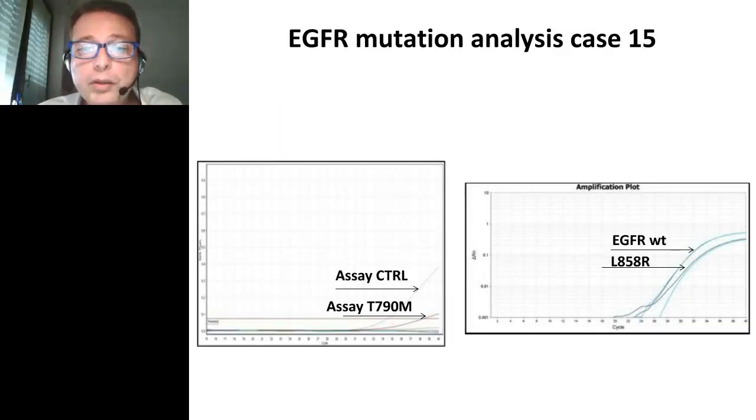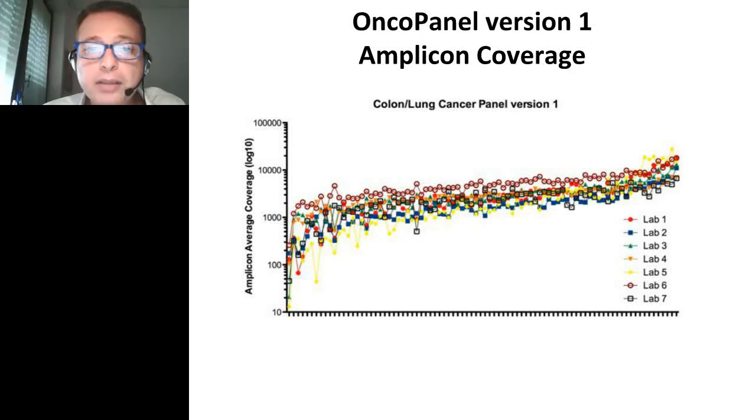So we took advantage of the fact that Life Technologies had available a new workflow for the design of primers, and we asked LifeTech to redesign the primers of our panel. And this new design was again assessed through different phases. We repeated phase 1 for reproducibility and accuracy, and also we went again to phase 3.